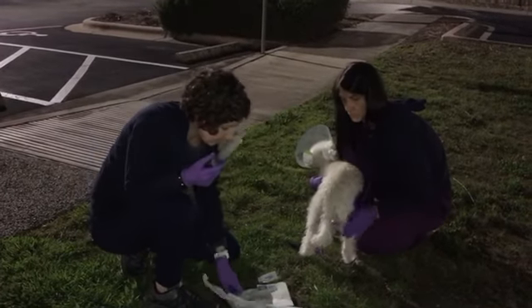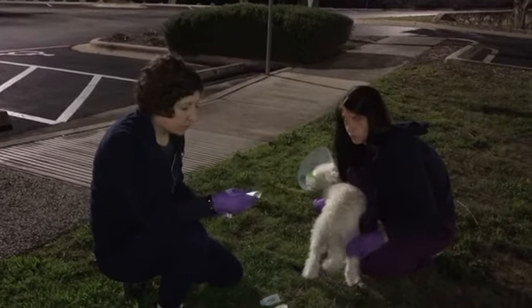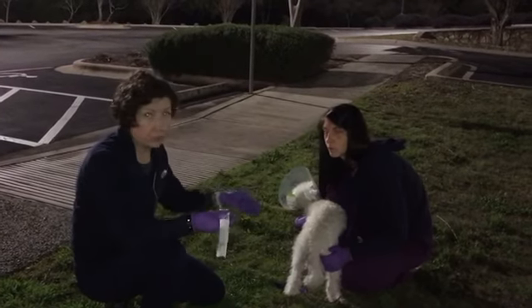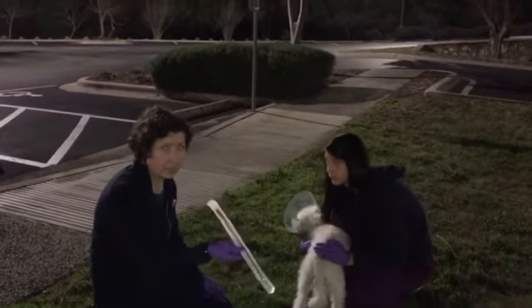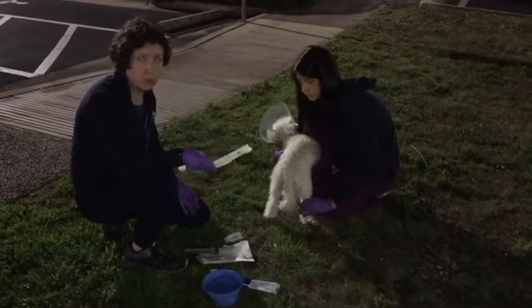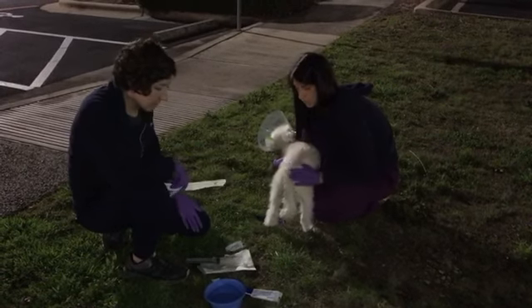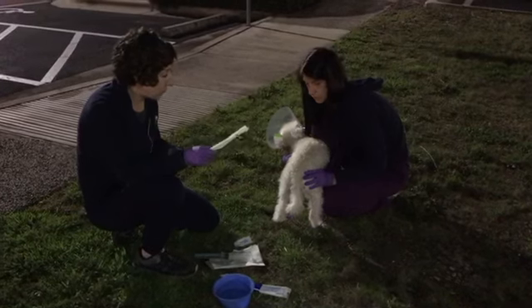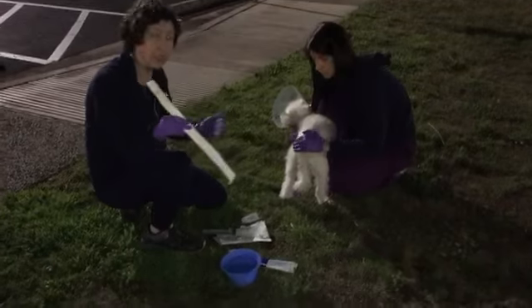So I have my sterile red rubber catheter, and this isn't a sterile procedure, but this is sterile. It is new to him, and we will be saving this and reusing it, but the first time we do it, it is sterile. So sometimes the doctors want to use soap in with their water, a lot of times with the jelly as well. Sometimes they could use lactulose, but this particular doctor just wanted about 1-to-1 ratio of lubricating jelly and warm water.